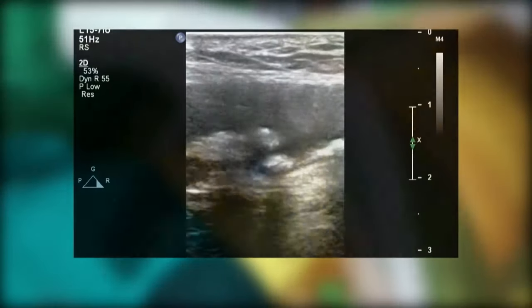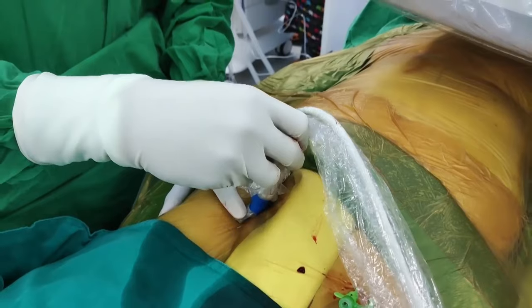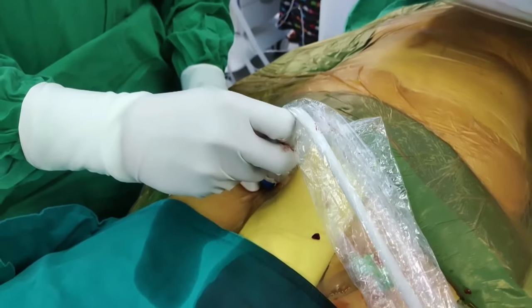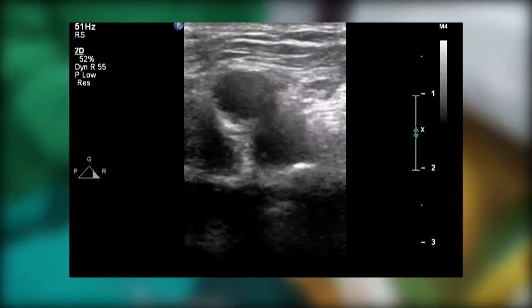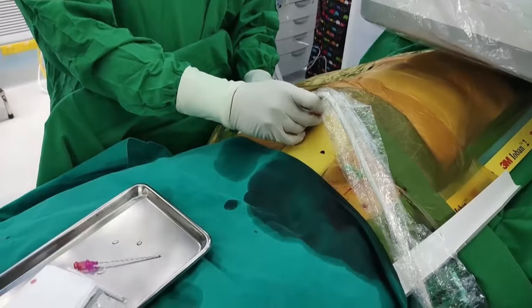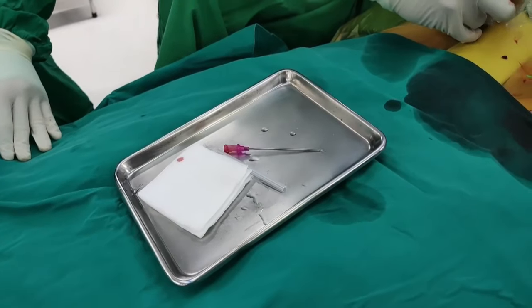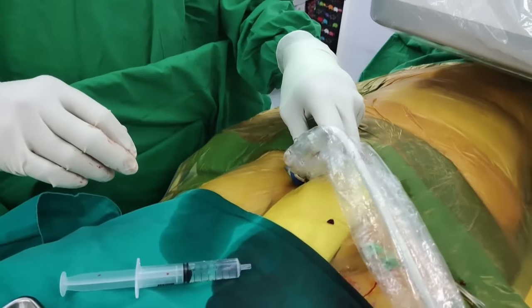In this view, you can appreciate where the femoral bifurcation is, and you can see the calcium more associated with the posterior wall in this patient. Then you rotate clockwise to obtain a cross-sectional view of the femoral bifurcation. In this view, you can see the bifurcation of the femoral artery together with the femoral vein, and then you move the probe cranially until you are out of the femoral bifurcation and choose where the puncture site is, which should be free from anterior wall calcification.